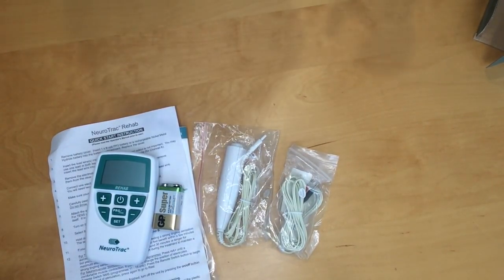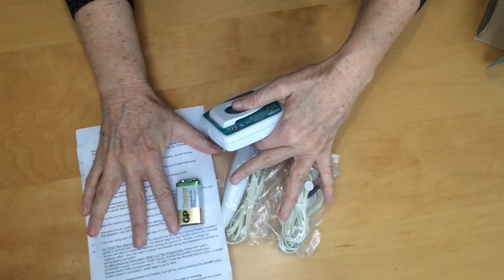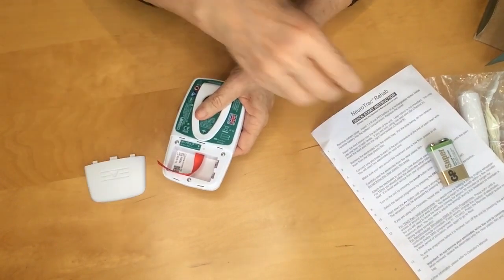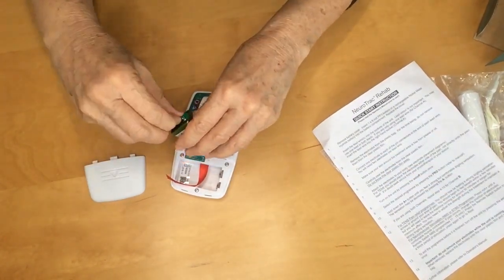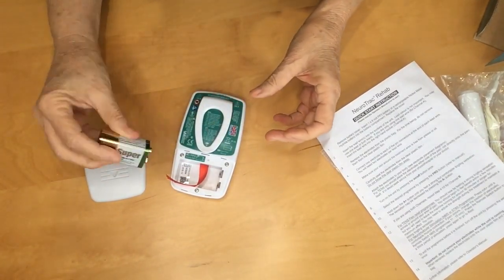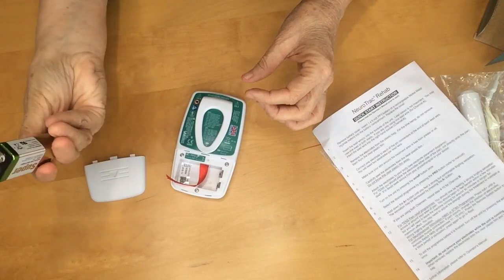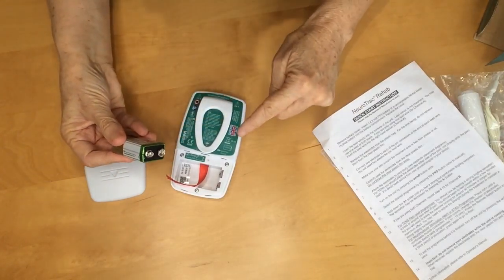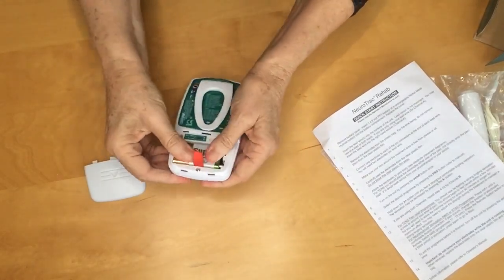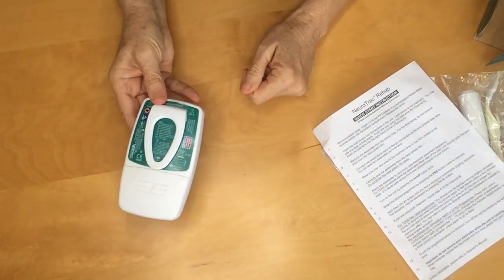So now I'll run through how quick and easy it is to actually set this up. I usually do this together with the clients so they can see how easy it is as well. Open up the back — there's a little bit of protector tape on the battery. One of the battery terminals is bigger than the other, so it's easy to figure out positive and negative. Close the back — all ready.